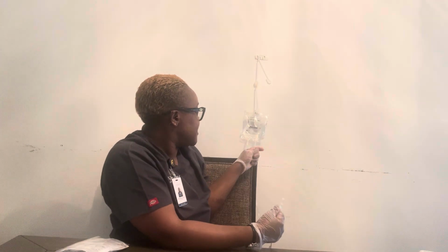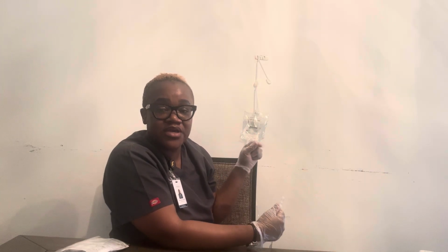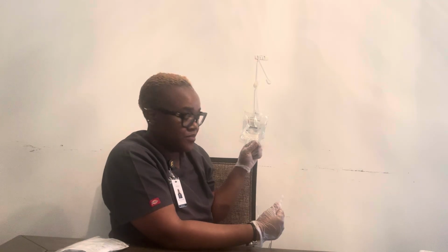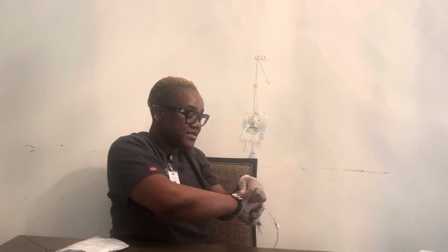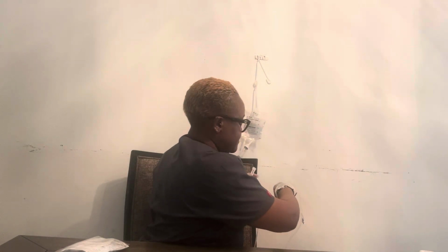All right, so the next thing I'm gonna do, I'm gonna slowly open my roller clamp so I could set my infusion rate. And for this primary, it is supposed to be 38 drops per minute. So I am gonna count for 1 full minute and verify that I have 38 drops per minute. Okay, so I'm gonna open. All right, so I'm gonna be counting for 1 full minute.